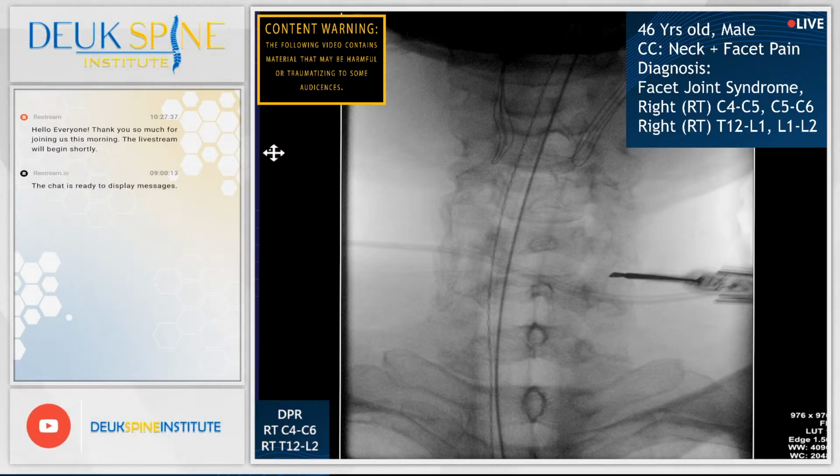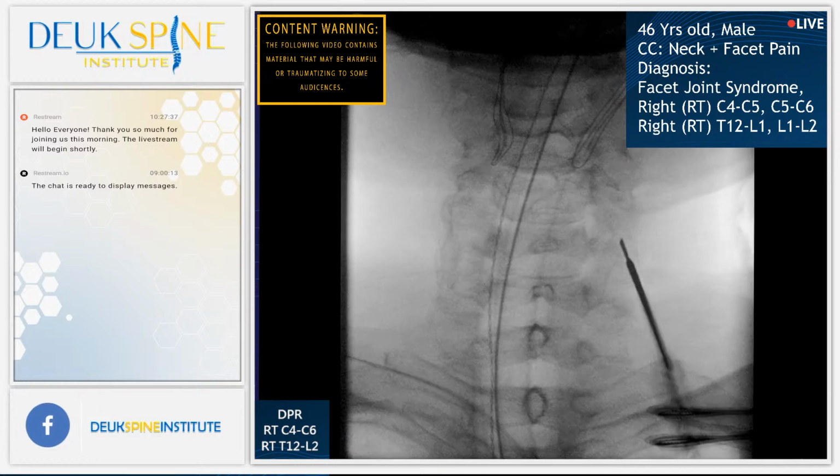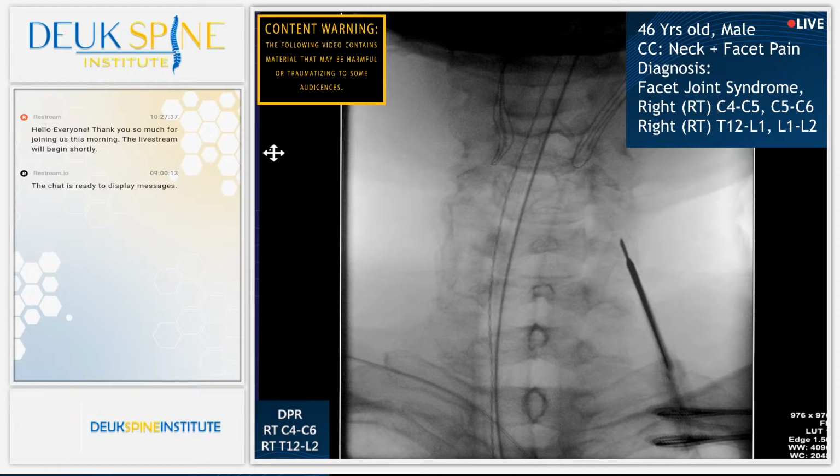It's the same target used for radiofrequency ablation. The difference is our procedure is a permanent radiofrequency ablation, whereas an RFA is temporary. Patients have to keep coming back and getting treatment. Our treatment is permanent.